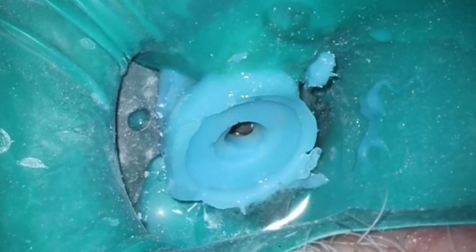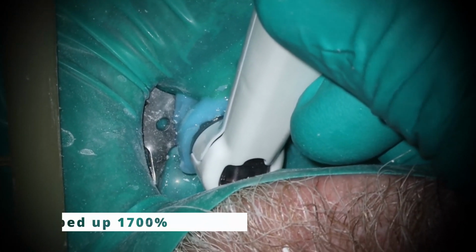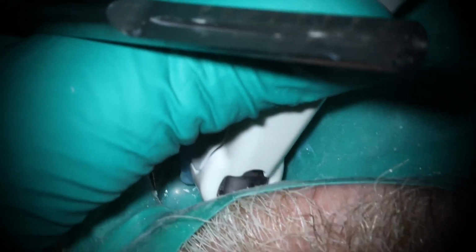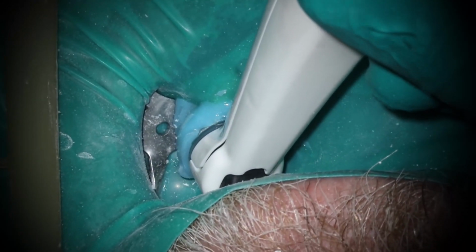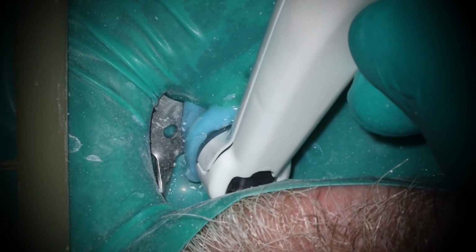So we're going to go ahead and run the cycle here. Like I said, I sped this up quite a bit. And you'll see me swap hands back and forth. One of the things I've realized you can do is using a bunch of keyboard shortcuts. When I switch it to the left hand, what I will be doing is usually doing my notes or something else, working on, I crop the pictures at that point, make sure everything's done. It just saves a little bit of time because we're going to be sitting there for 8 minutes anyway. Like I said, this has been sped up quite a lot because you don't need to see it just sitting there for 8 minutes. That would be a very terrible video. And all of you would probably click off.